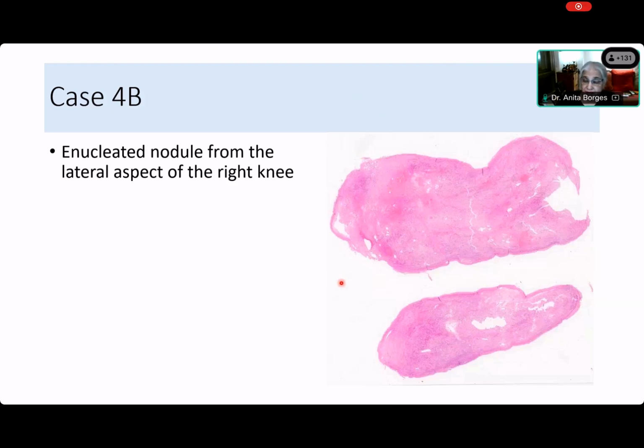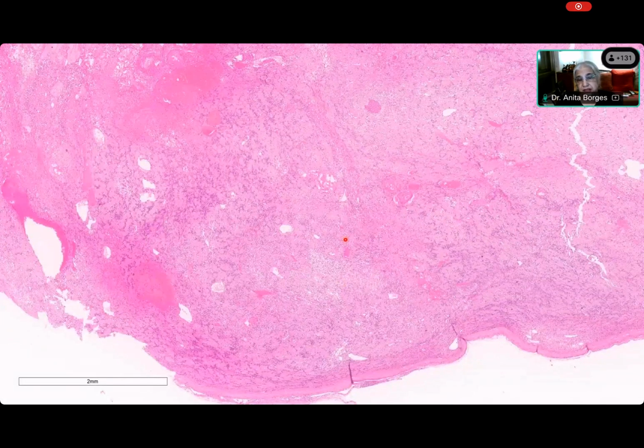Right. So this is an encapsulated lesion. Now you can see that even in hyper. Yes, come on, it's got a capsule. Now what do you see here? Come on, Saida, quickly. Ma'am, the hypercellular Antoni A areas and the hypocellular Antoni B areas.